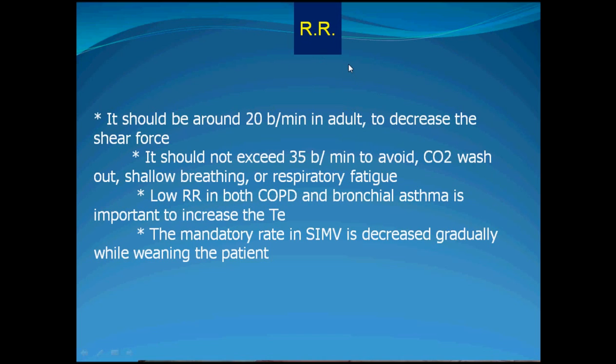A very important point for the respiratory rate is in cases of COPD and bronchial asthma, and this should be considered. The respiratory rate in SIMV is the total: the mandatory rate plus the spontaneous respiratory rate.